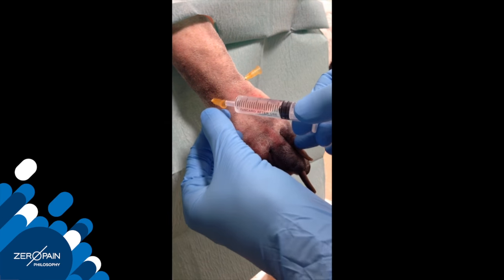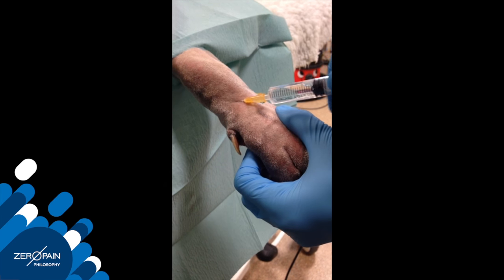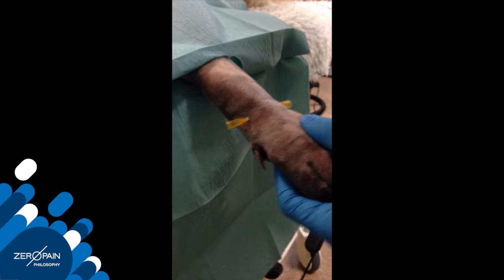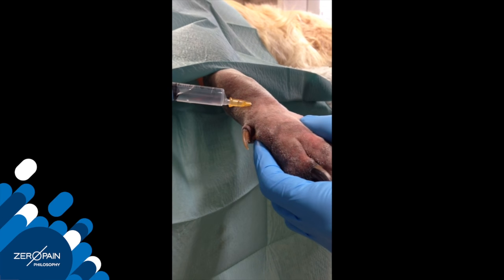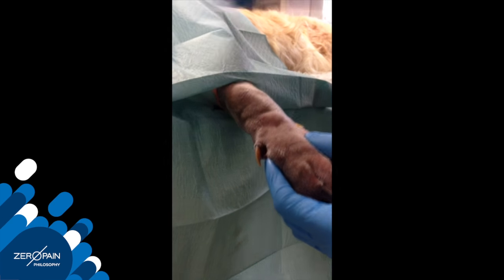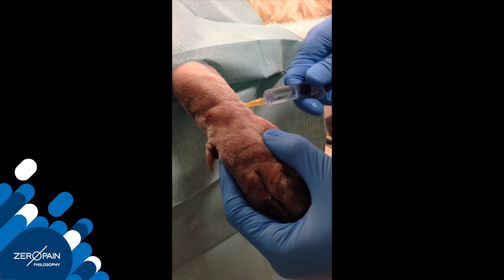A volume of 0.1 to 0.2 mls per kilo local anaesthetic solution is prepared prior to performing the block. The importance of aspirating prior to injection is highlighted here, when blood is aspirated into the syringe and needle hub. The injection should be abandoned and the needle moved to a new site and a clean syringe of local anaesthetic used prior to injection.